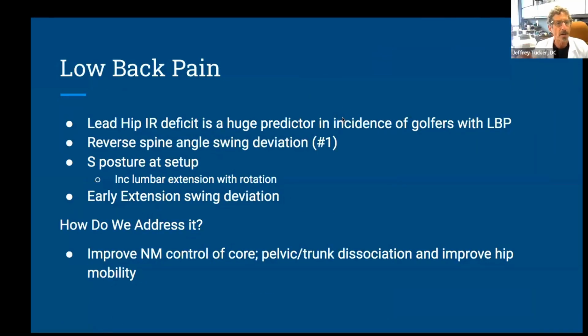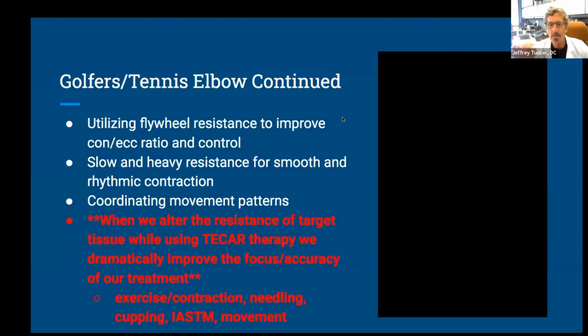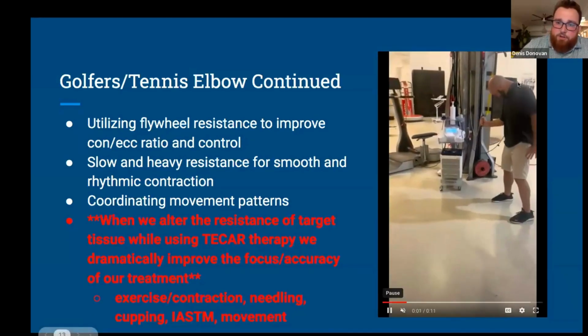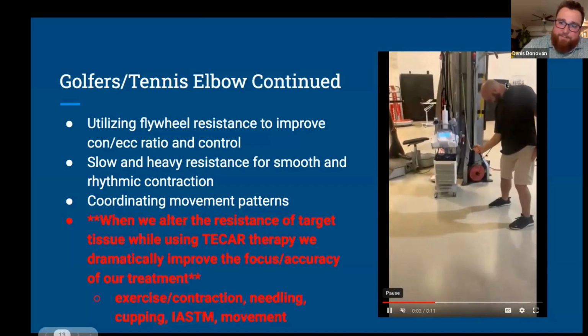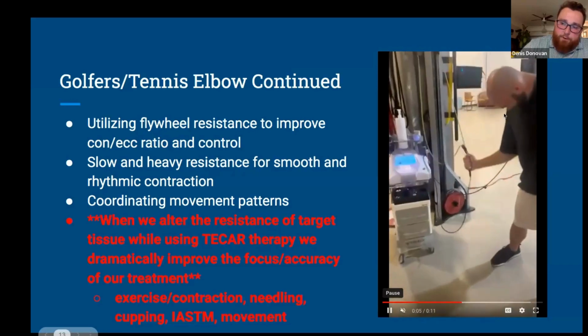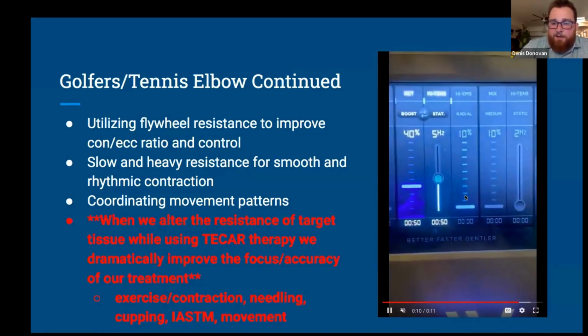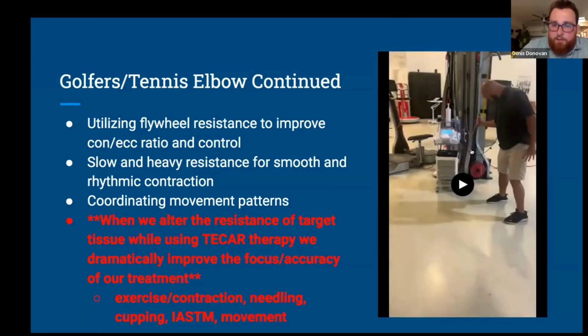Dennis, can you put your arrow on where you had the ground? Yes, sure, absolutely. So the ground in this is actually on the posterior aspect of his right upper thorax. You can't really see from the video, but you can kind of see where this wire comes in here, and I have the adhesive up on his right shoulder blade, basically. Thank you. Of course, yeah.